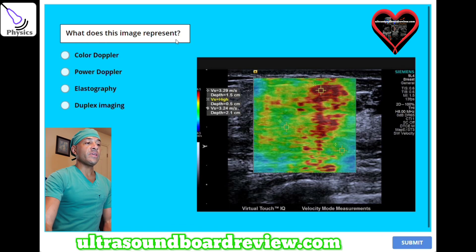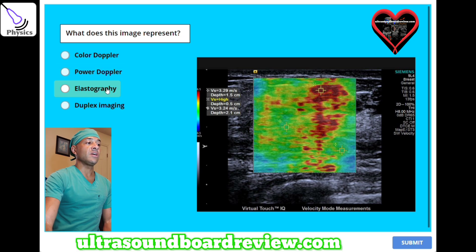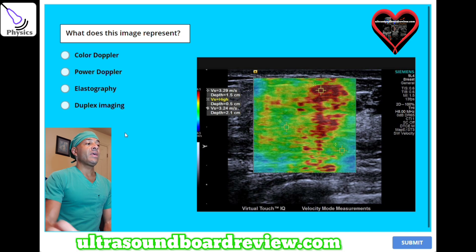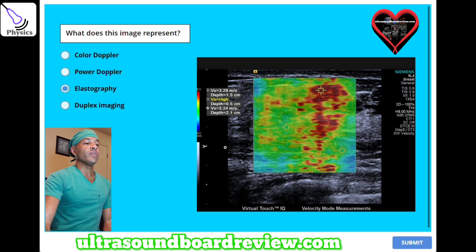What does this image represent? A, color Doppler. B, power Doppler. C, elastography. Or D, duplex imaging. The answer is C — elastography.